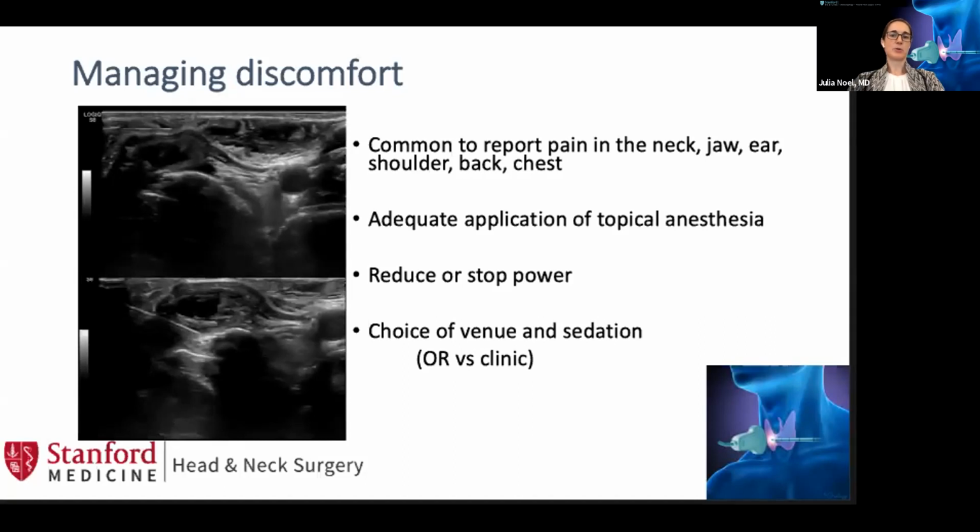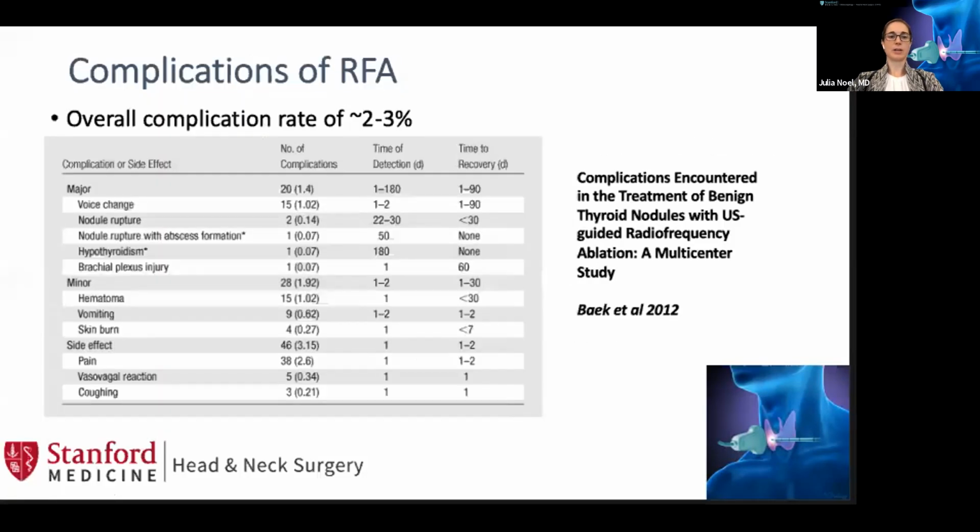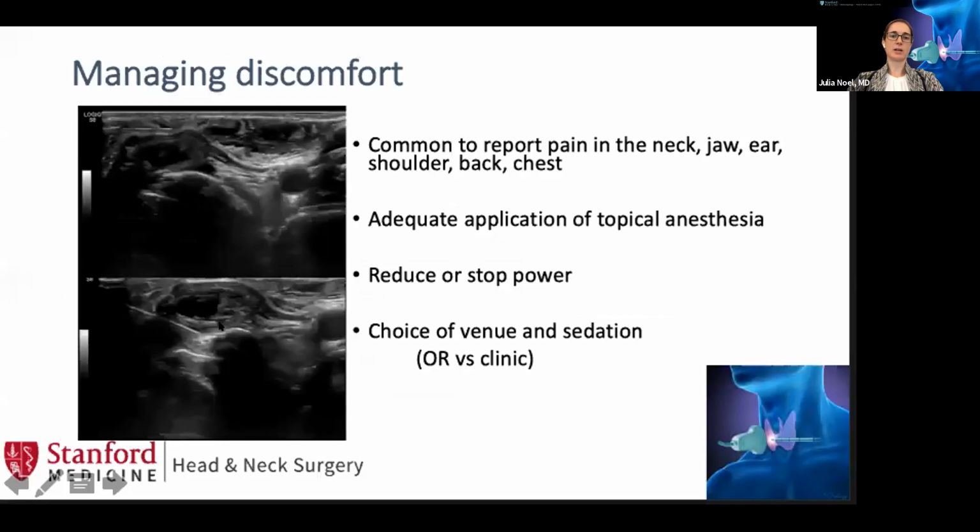The sensory nerves, for the most part, are on the capsule of the thyroid gland. So this is the area that you really want to target with local anesthetic. And you can see in the photos on the left here, there's a needle trajectory sort of along the anterior capsule of the thyroid gland here, and then the posterior capsule here, which serves the dual purpose not only of delivering anesthetic, but also of lifting that nodule off the thyroid cartilage, which was sort of positioned in the pyramidal lobe.